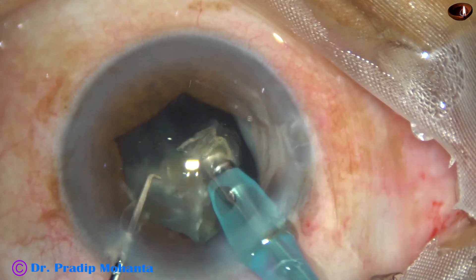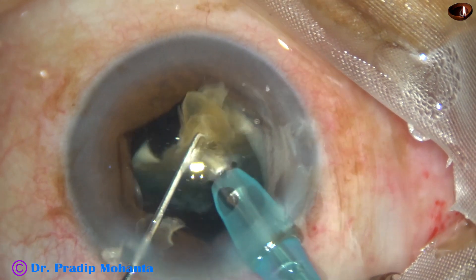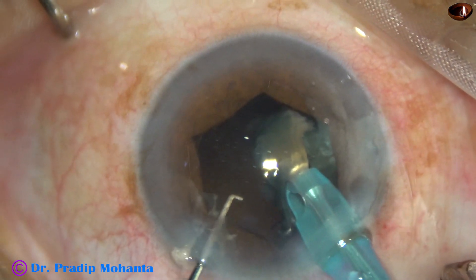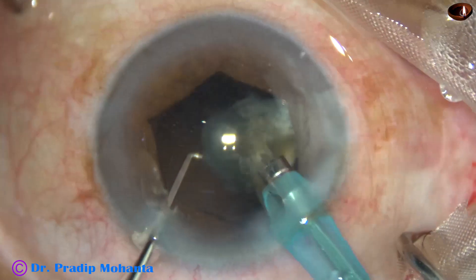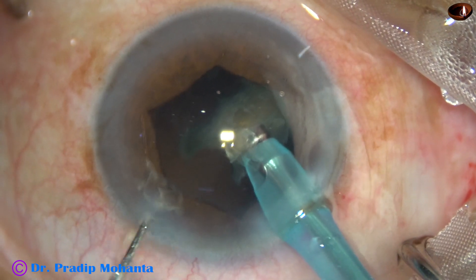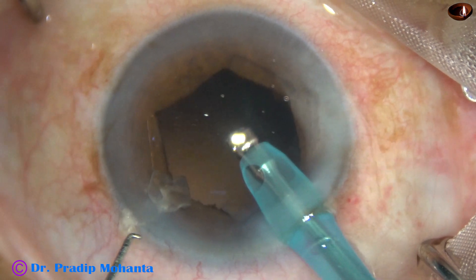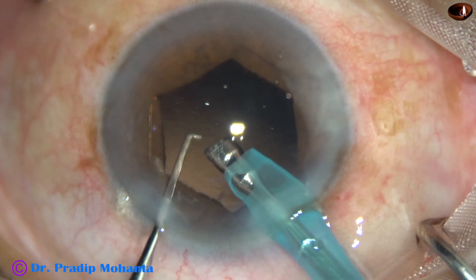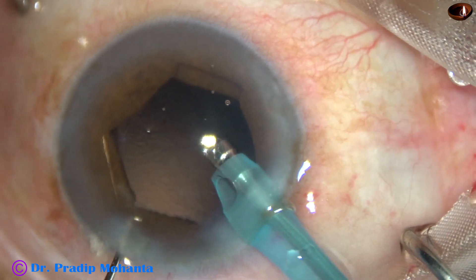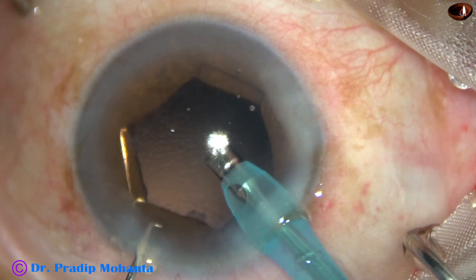It is not necessary to divide the nucleus into many fragments — make four fragments, and then each fragment can be subdivided into two small parts if necessary. This is the last bit of the last fragment, and at this time the vacuum is reduced to about 200, and the last piece is safely emulsified. The last fragment is being removed through the side port itself.